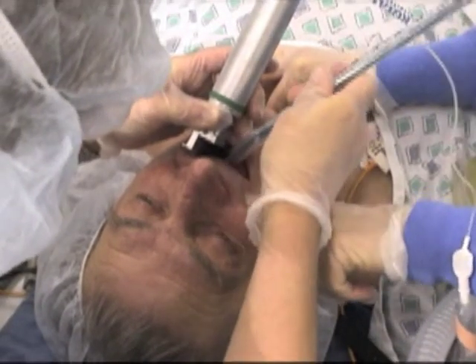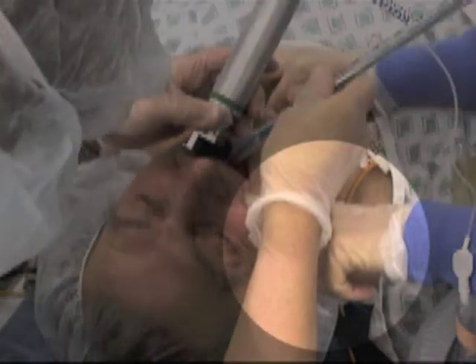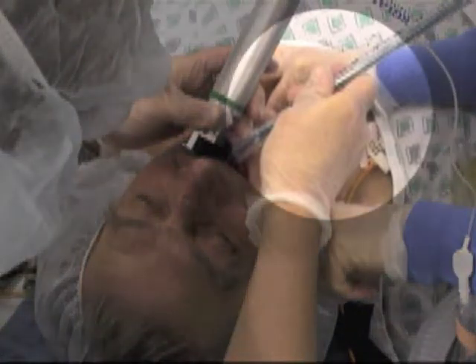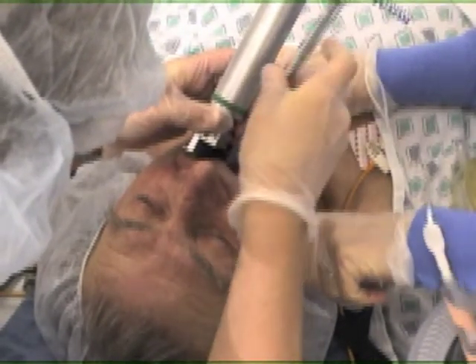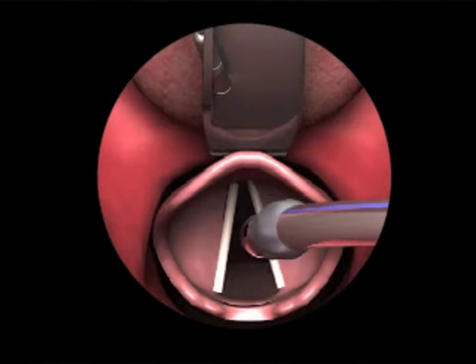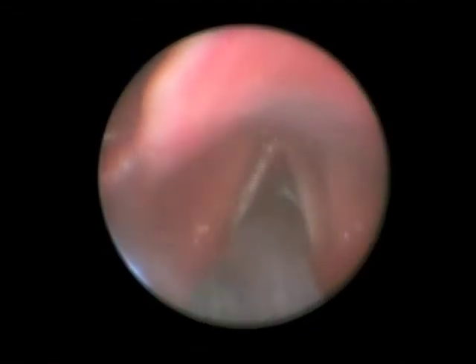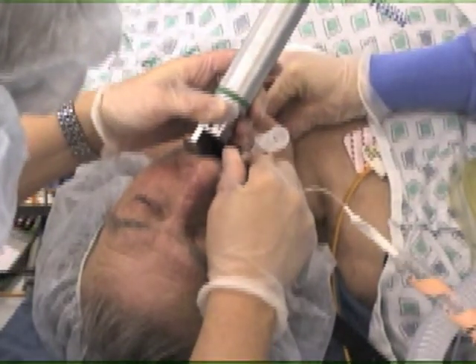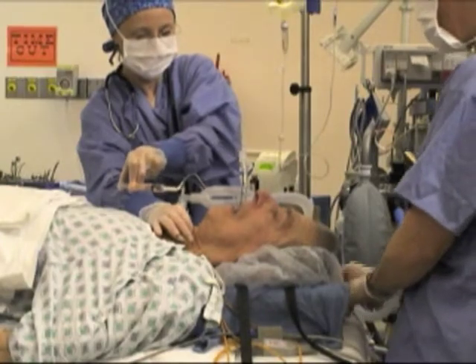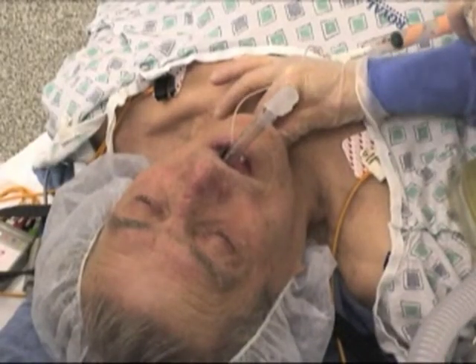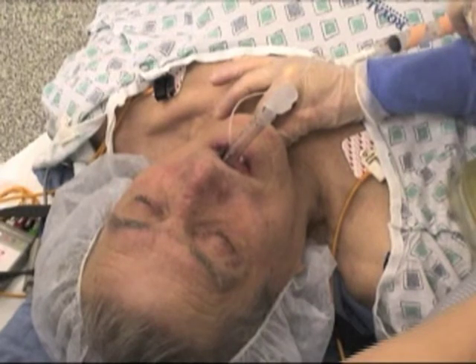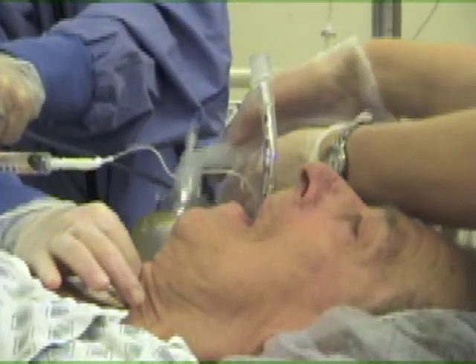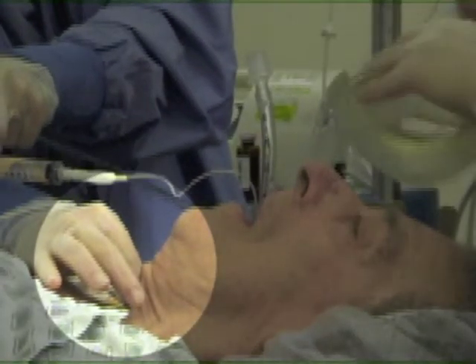If available, an assistant should gently pull on the right side of the cheek to enhance visibility of the glottis. Hold the endotracheal tube in your right hand. While maintaining your view of the vocal cords, insert the endotracheal tube into the right side of the patient's mouth; the tube should not obstruct your view of the vocal cords during this critical part of the procedure. Pass the tube through the vocal cords until the balloon disappears into the trachea. Remove the stylet and advance the tube until the balloon is three to four centimeters beyond the vocal cords. Inflate the endotracheal balloon with air to the minimum pressure required to prevent air leaks during tidal volume ventilation with a bag; this usually requires less than 10 cc's of air. The assistant must maintain cricoid pressure until tube placement in the trachea is confirmed.